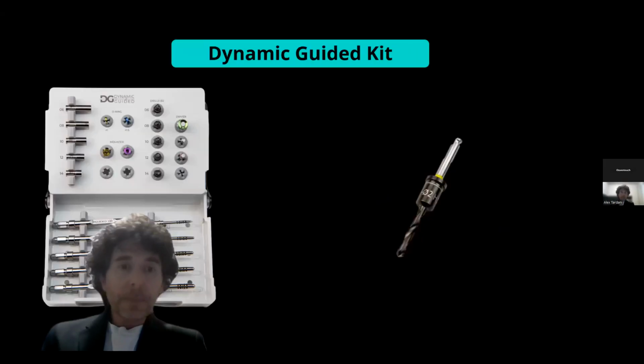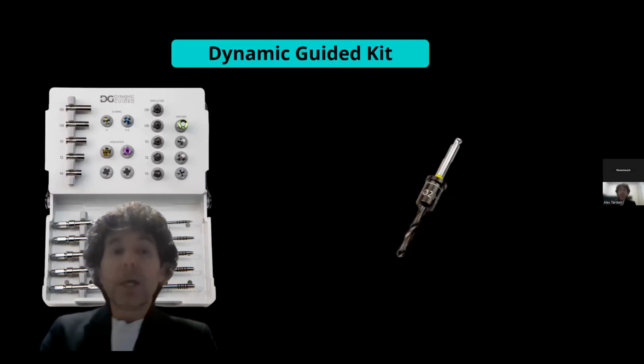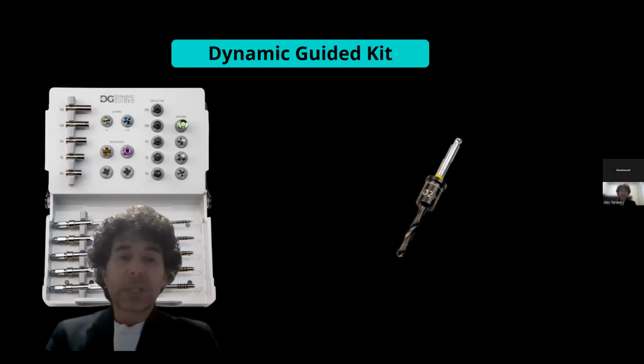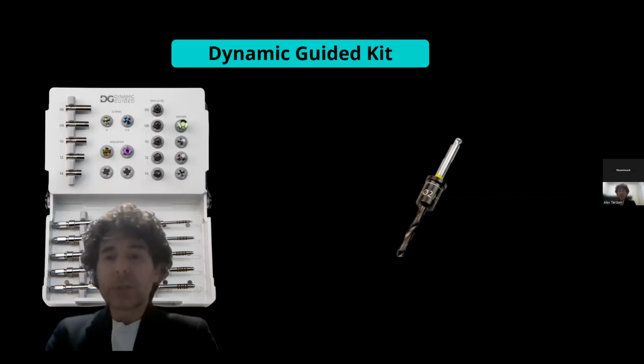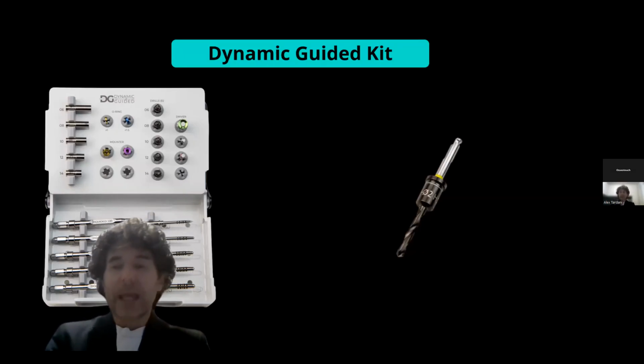And as I was saying before, I'm not against using drills, but even in the kit itself, we still find a 2 mm drill, so a classic pilot drill. Why? Because there are situations where the use of the mallet can certainly give us great advantages, but at the same time, we might still face bone that tends to become too dense, too hard, and so using a drill definitely helps us in our work.